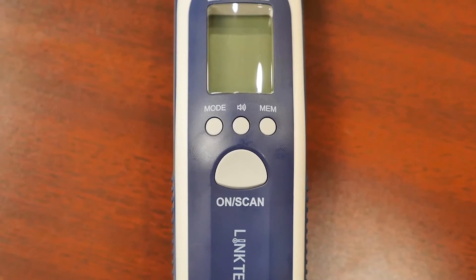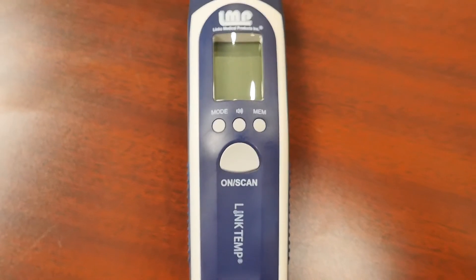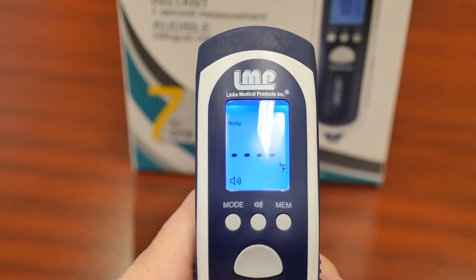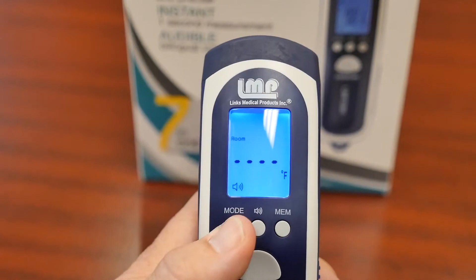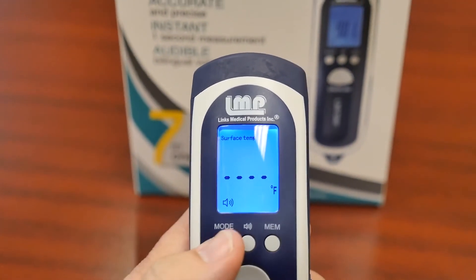The LinkTemp Non-Contact Infrared Thermometer can take body, surface, or room ambient temperature. While the thermometer is turned on, press the mode button to toggle through the three temperature mode options: body, surface, or room.